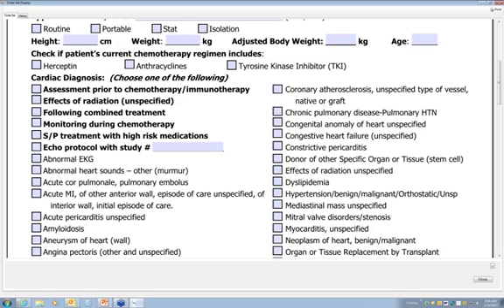We have four GE machines in our lab, and four iE33 Philips with the upgrade, but we have had some issues with the reproducibility of the measures on the Philips, so we're sticking mostly to the GE for the strain. I'm sorry to say that.